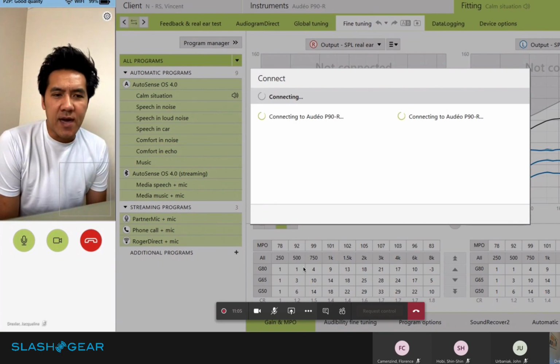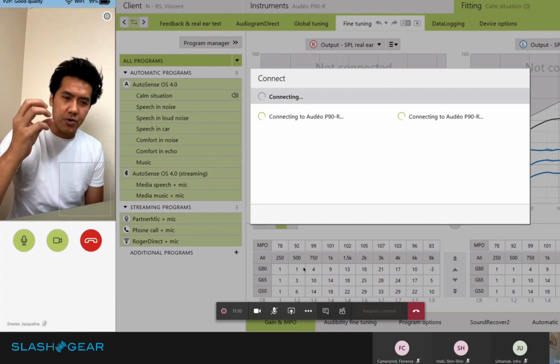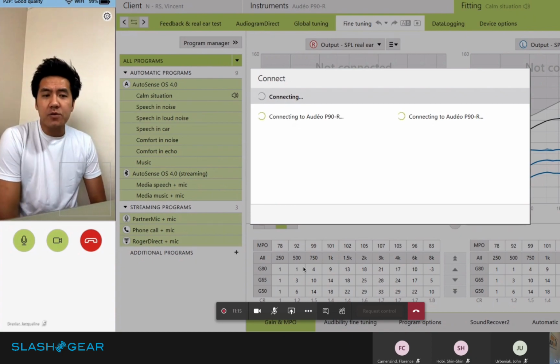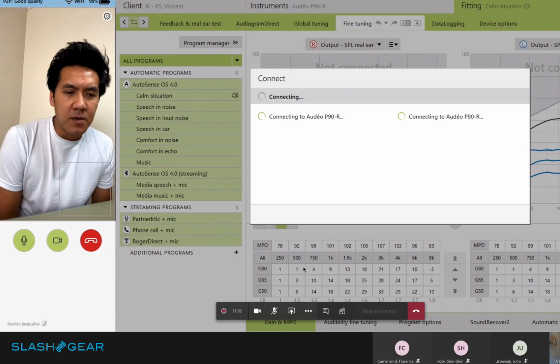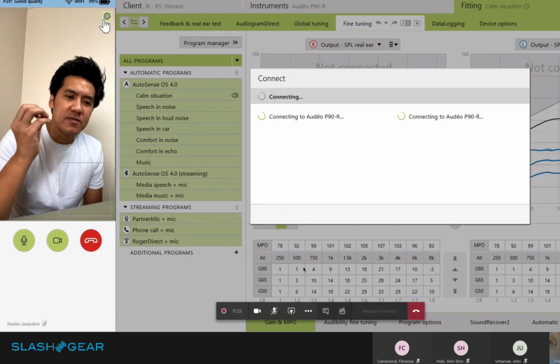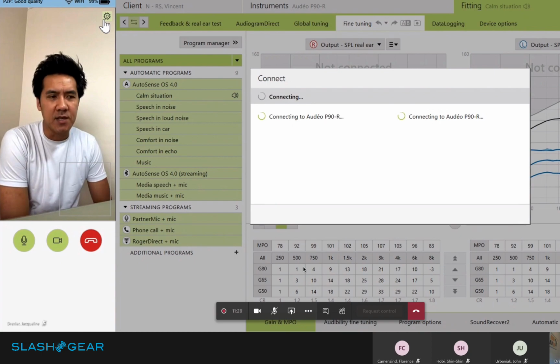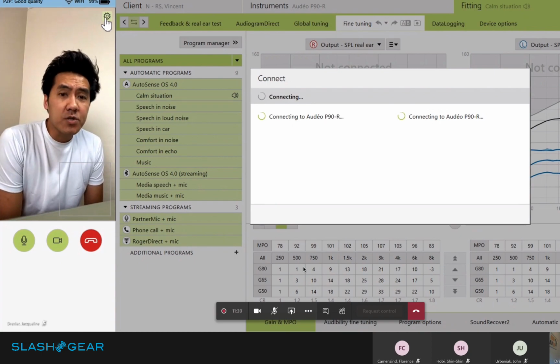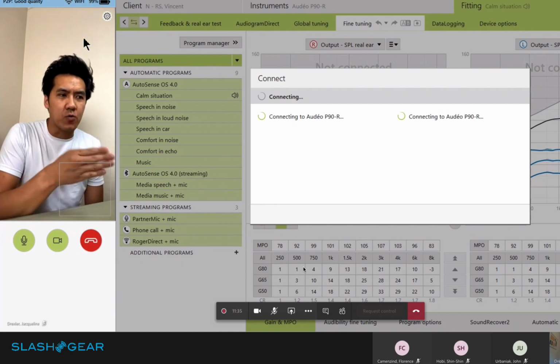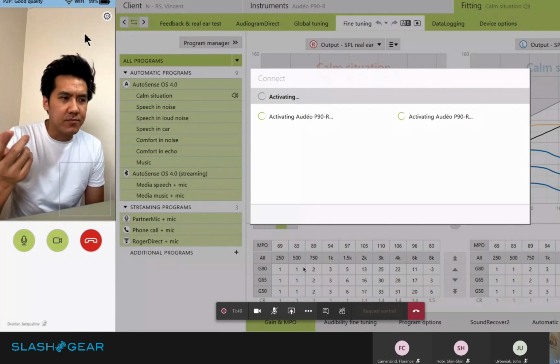Other than that, I was on the plane on Friday, and I was able to try them with the thicker insert, and it works much better than the other ones I've had. But when I'm moving around a lot, it seems like it blocks the receiver. So I've talked to John about getting some other sizes in. Other than that, it works quite well. I'm curious how far back or which settings you actually loaded up as my profile?